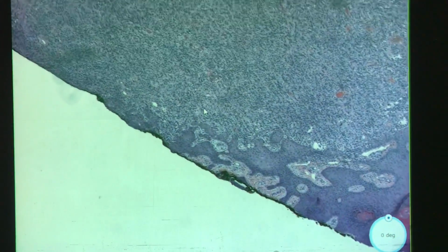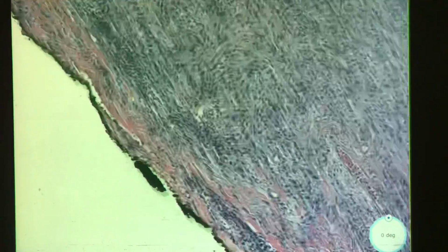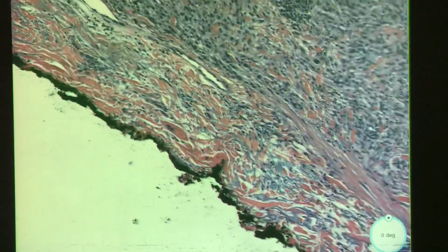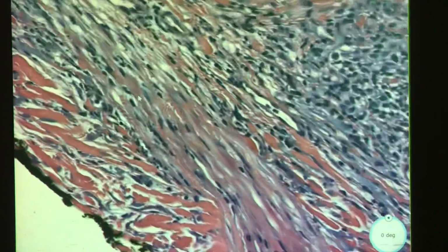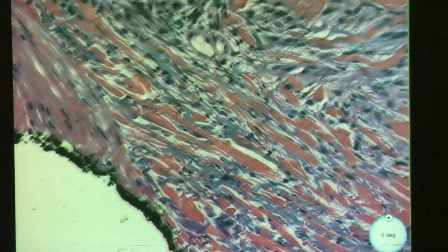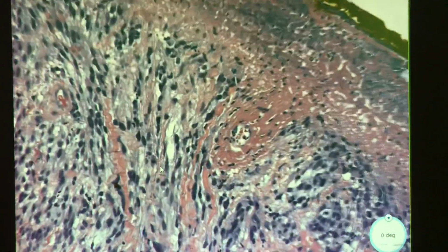I think it's hard to tell because it's oriented weird. Yeah. It looks like maybe it's ulcerated in some areas. Okay, so it was on the ink on the other piece and still on the ink here. But you do start seeing more of the normal dermis here. So it looks like some sort of elastosis, aka just bluish junk. It does look like it's kind of maturing, I think, because the cells look a little bigger, but I could be just imagining things. I don't know. Maybe not. Never mind.